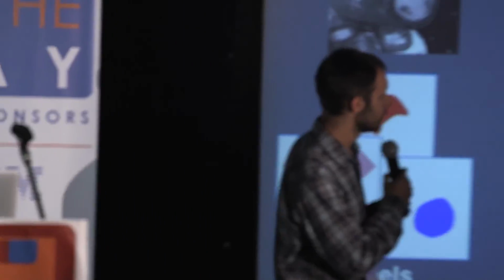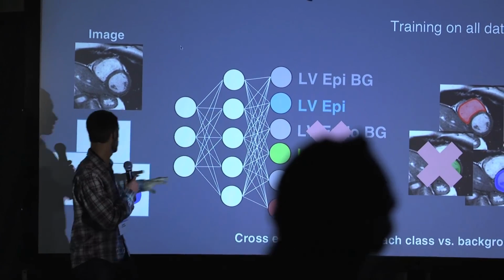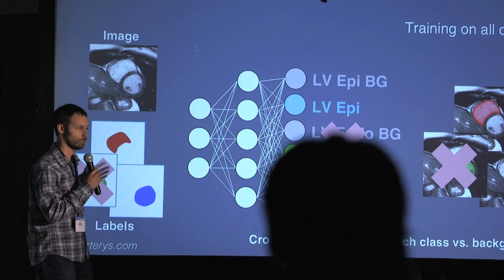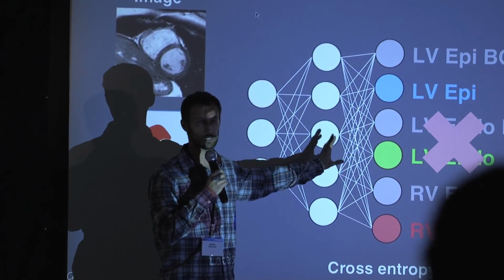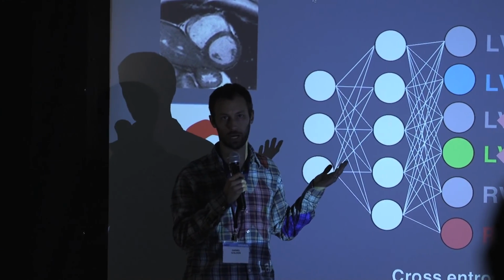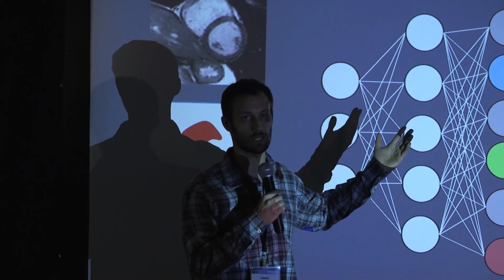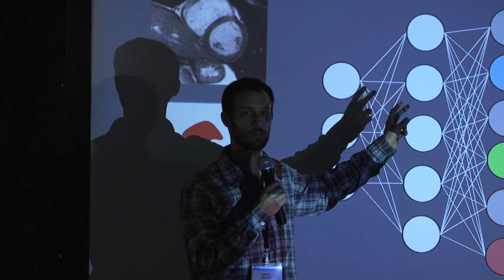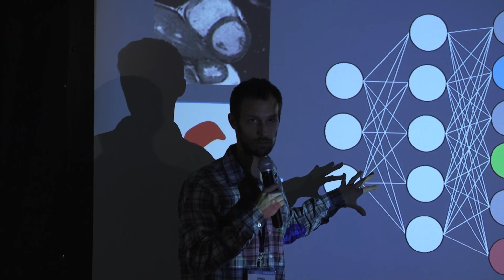So when training and this data comes into the network, this ends up being set to zeros, which is okay because it's ignored anyway. We essentially have a flag, which is just how we arrange the data, to indicate to the last layer of the network, which is right at the loss function, that we do not have information there. Then within the TensorFlow graph, we actually just delete the components of the loss. The loss ends up being a vector that has the same length as the total number of pixels that came in. We just say that the components of that vector that correspond to that missing mask, delete them, take the average of the remainder, and backpropagate that. Does that answer your question?